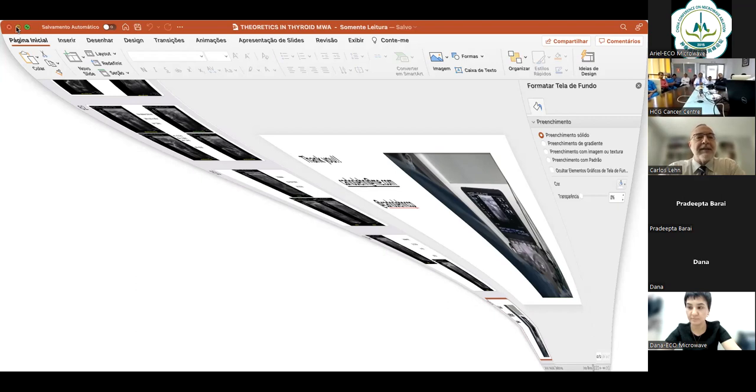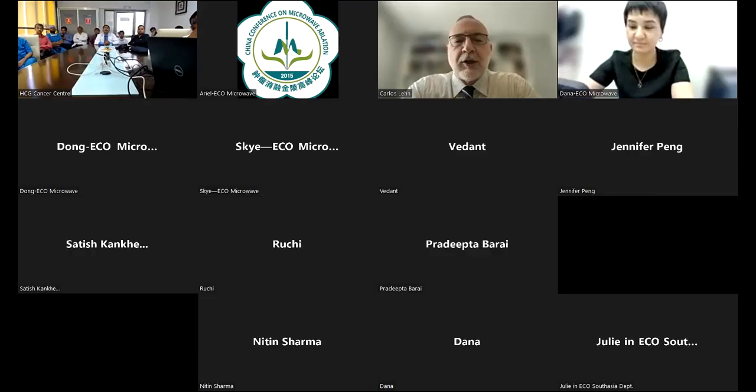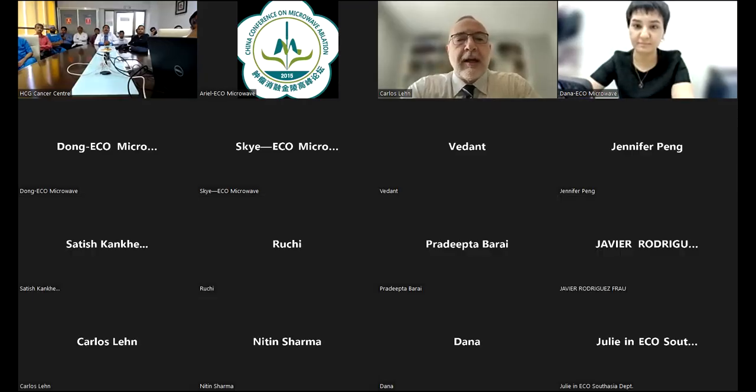For Bethesda 3 and 4, there is no evidence in the literature showing us that this procedure is safe. Why? Because you may be dealing with follicular tumors that have another kind of behavior, or papillary carcinoma. And for malignant disease, we are starting our protocol.